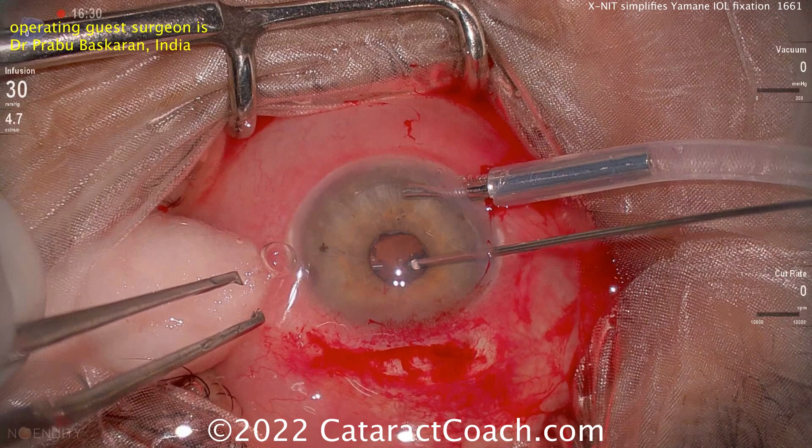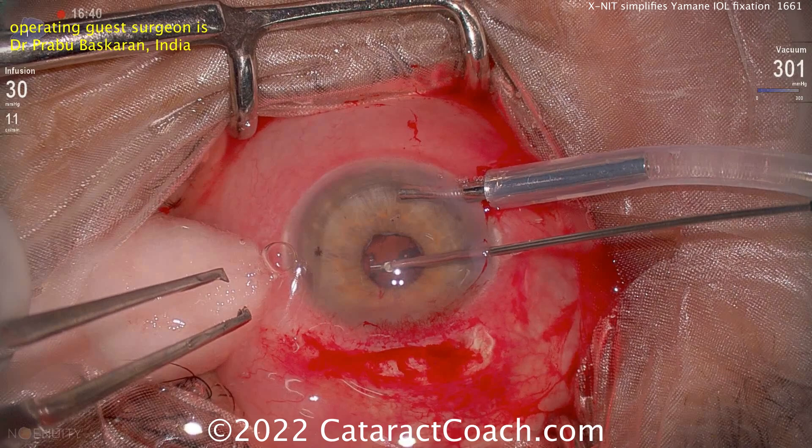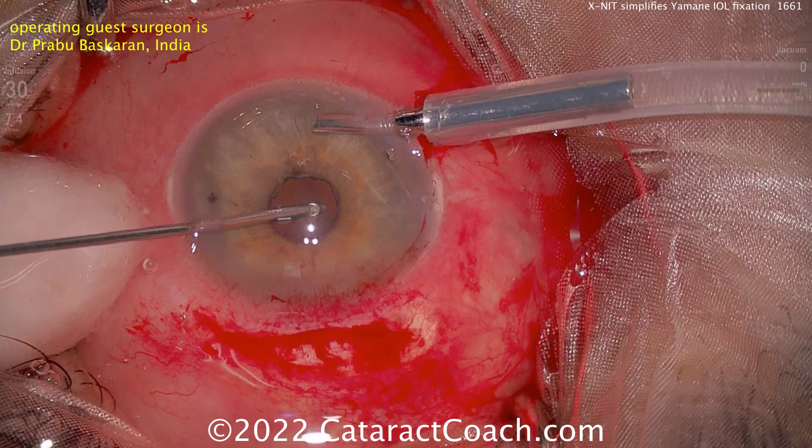What are your options? You could definitely put an anterior chamber lens in the eye, and there's no harm in that. Many studies, including meta-analyses, have shown that it's very stable and can have great results, performing about the same long term as patients who have sclerally fixated posterior chamber lenses.